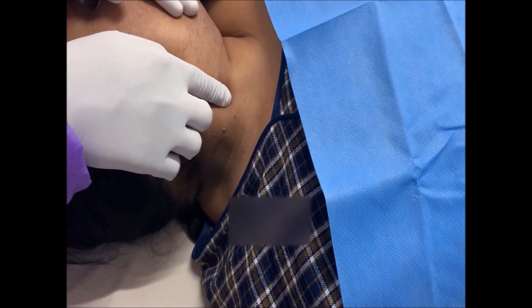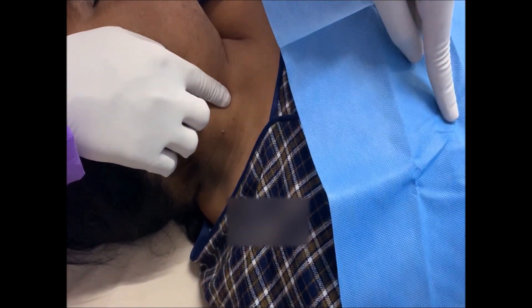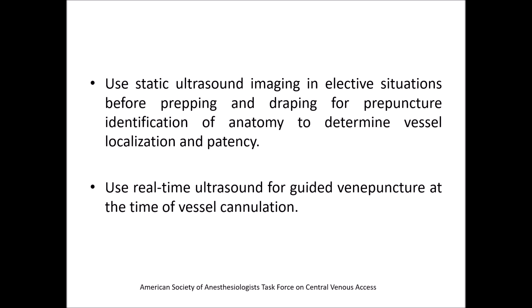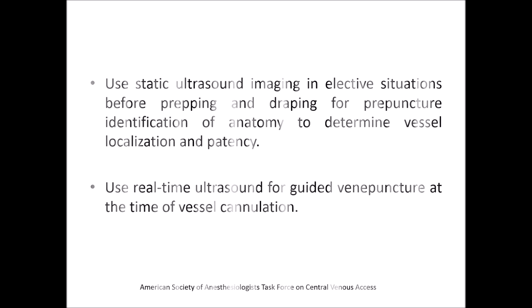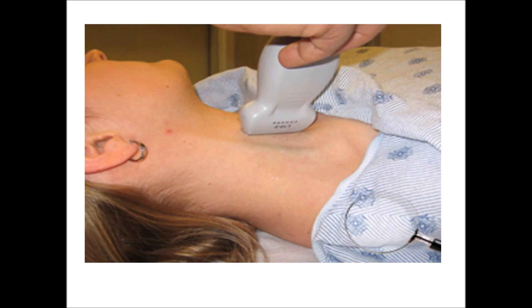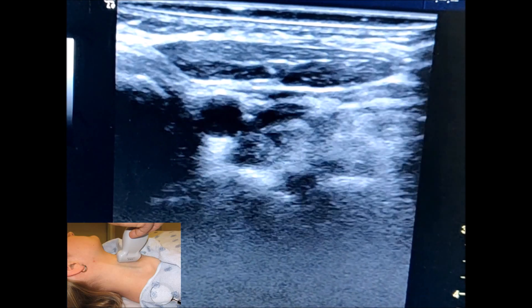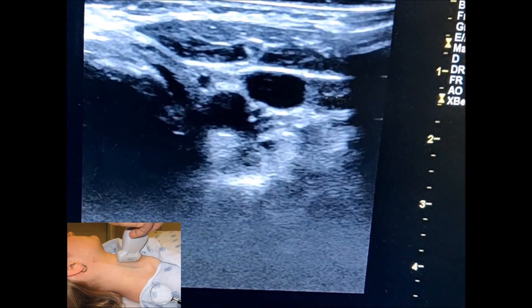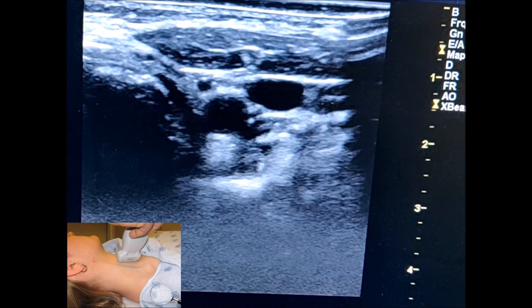The needle is inserted at this point and directed towards the ipsilateral nipple. It is advised to use ultrasound to determine the patency and localization of the internal jugular vein, and to guide venipuncture at the time of vessel cannulation. The ultrasound probe should be kept over the needle insertion site. The jugular vein can be localized by applying gentle pressure with the linear probe — the carotid artery does not collapse due to its tough muscular sheath, whereas the jugular vein collapses.